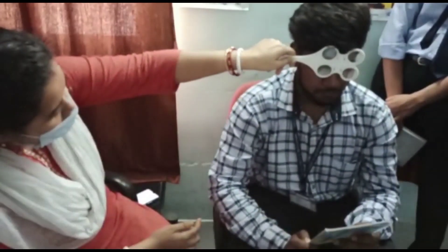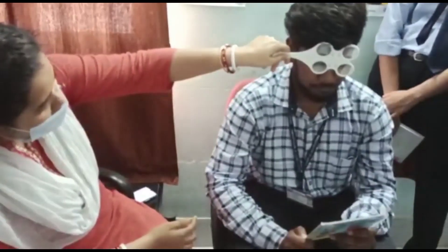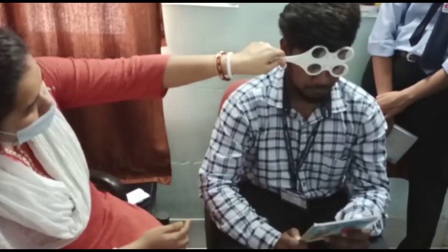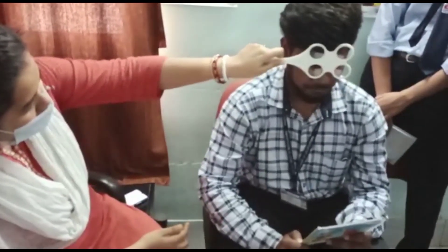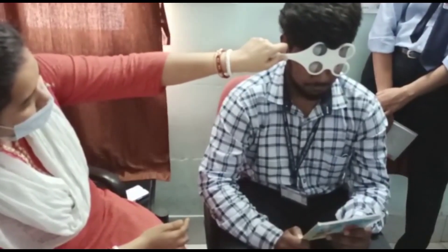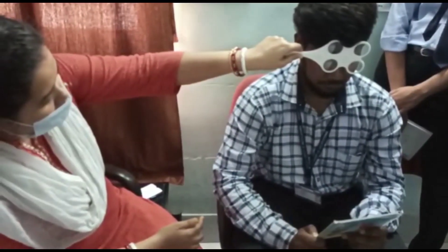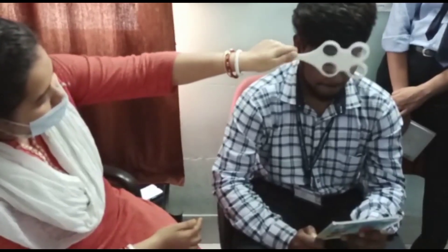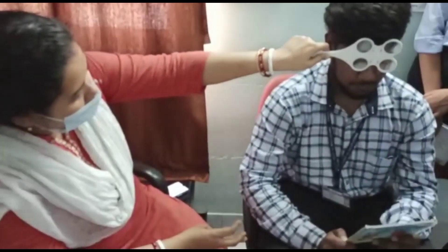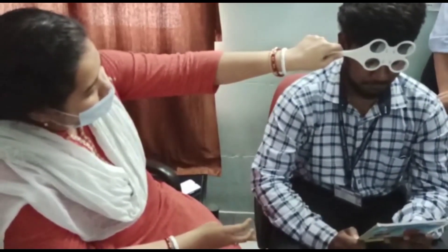You have to start with the +1.5 lens. Blink and try to make it clear. Try to make it clear — once it gets clear, try to blink and try to make it clear.